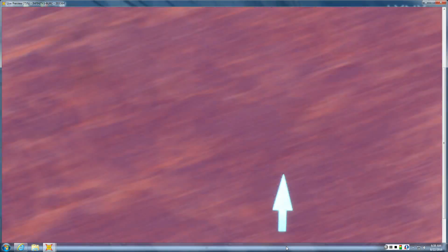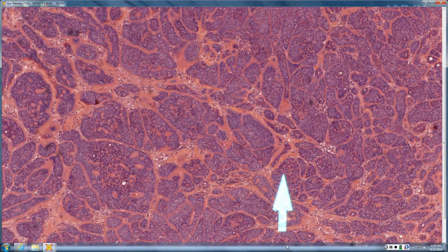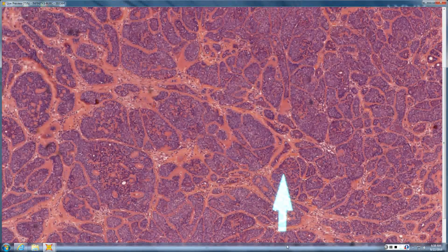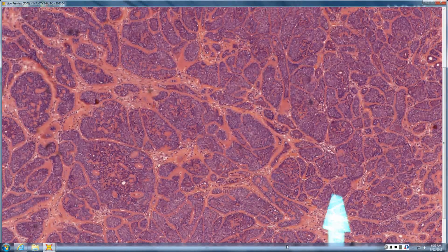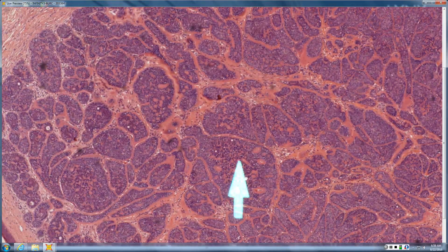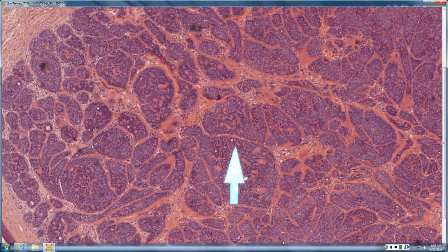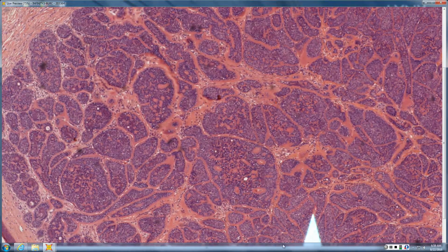There are some clinical things to remember. Cylindromas are usually associated with the familial Brooke-Spiegler type or multiple familial trichoepitheliomas, so it's usually more syndromic, whereas spiroadenomas are more sporadic. Even in this cylindroma, you can see these little hyaline droplets, and you get very dense hyalinized basement membrane here. That hyaline deposition is what clues you into a spiroadenoma when you have a big, huge proliferation with those little hyaline droplets, but of course you can get that with this as well.